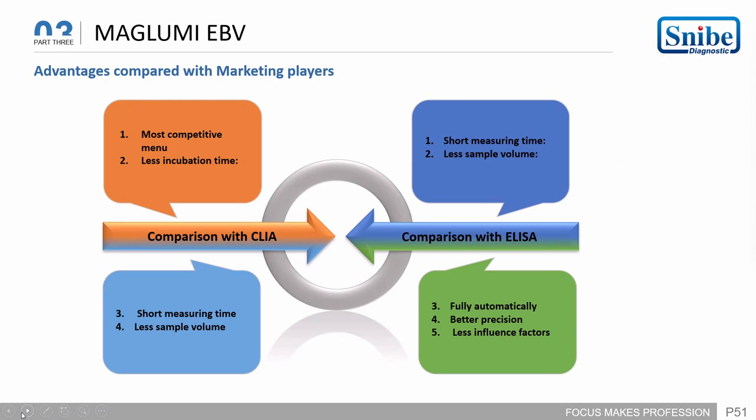In just a few assays they have 18 minutes and 9 minutes, while otherwise they usually have a pre-treatment assay, where incubation time is longer. If the assay time is low, why is the instrument throughput less than the Snibe analyzers? So it doesn't matter in the IVD market.